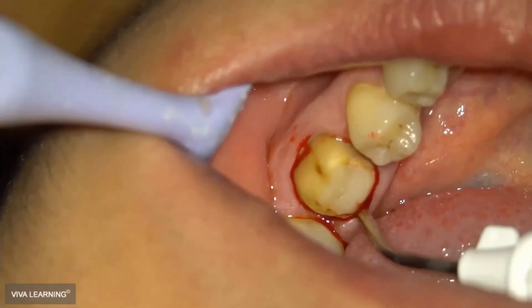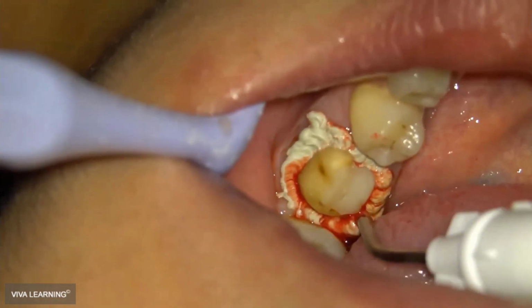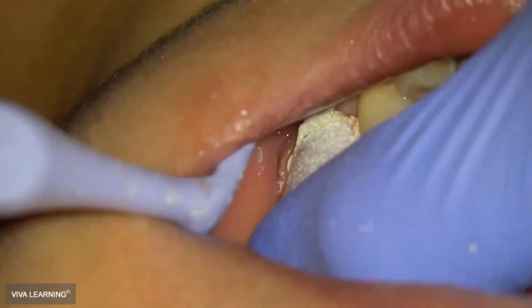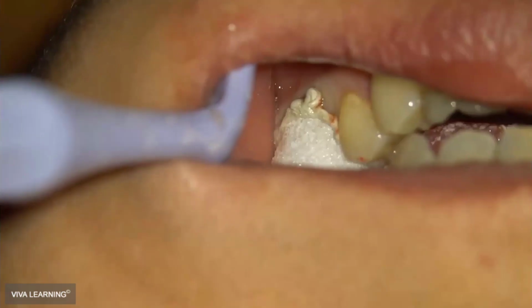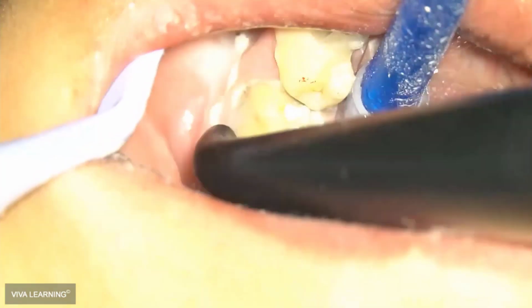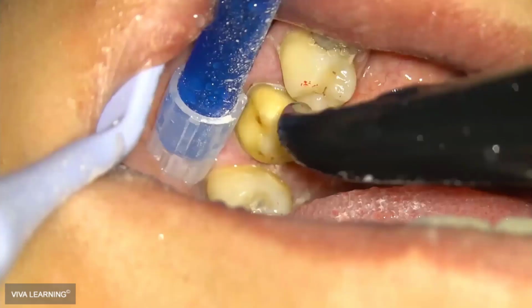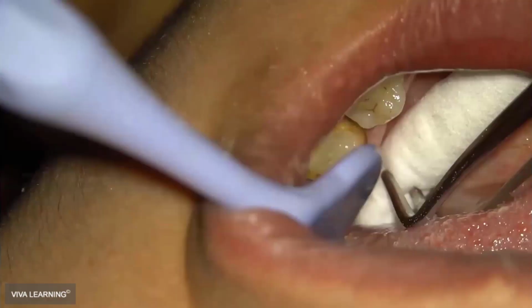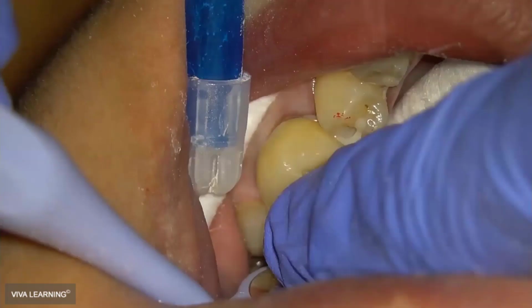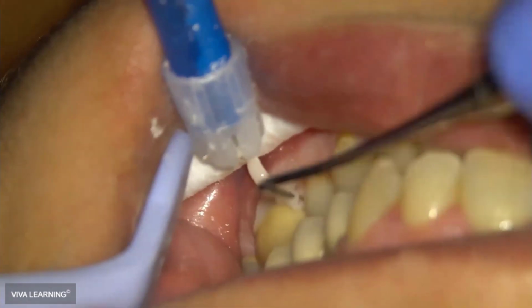And the issue then is you have bleeding, you cannot cement. First thing you want to do is to stop the bleeding. We are applying the paste. This is called the Gingicap. You have it in the kit. Put it around, ask the patient to bite for 2-3 minutes. You have additional pressure, and then you can wash it, and don't be afraid, use a lot of pressure. There will be no secondary bleeding. Now the preparation is clean. You can cement the crown without any issues.